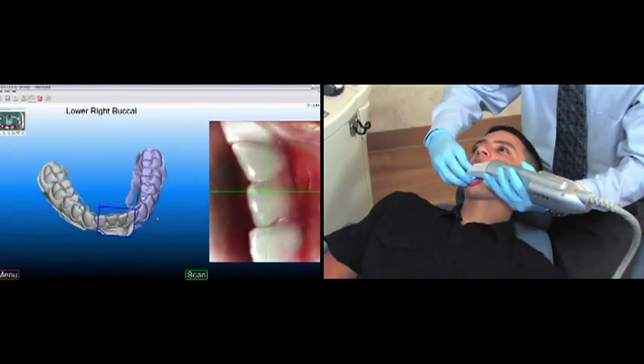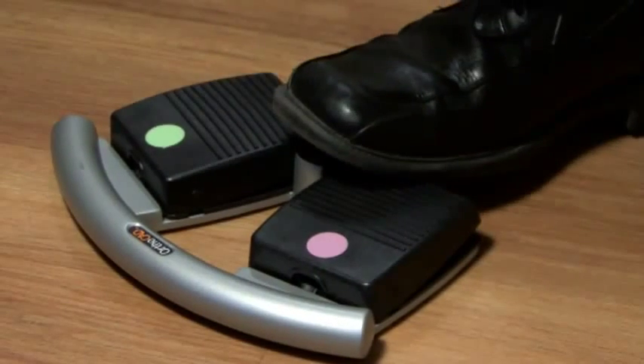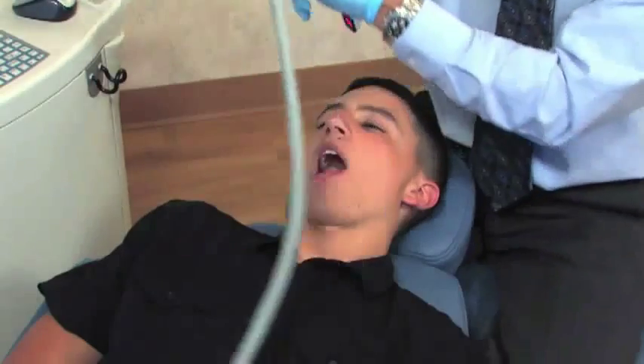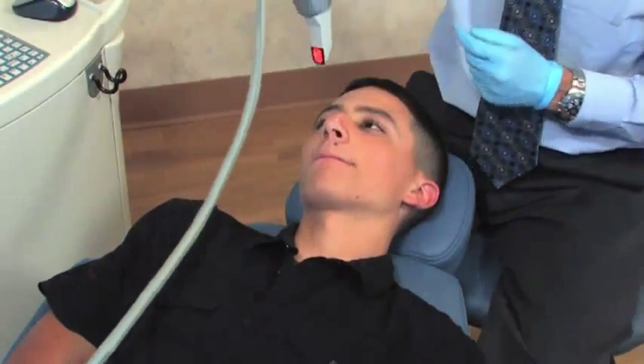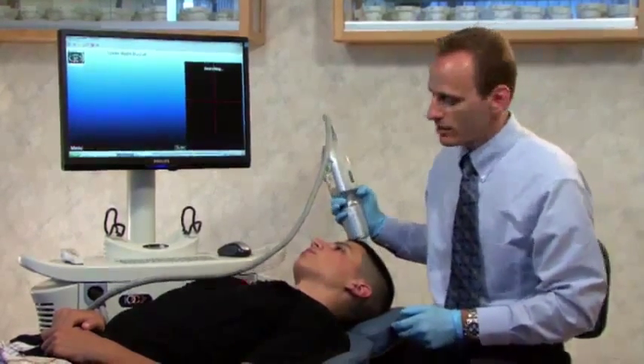When you're happy with your scans on the occlusal, press the pink foot pedal, then the green, to move to the lingual scans. The lower arch appears to be complete, so I'll press the pink pedal, then press green, saving and moving to the next segment.